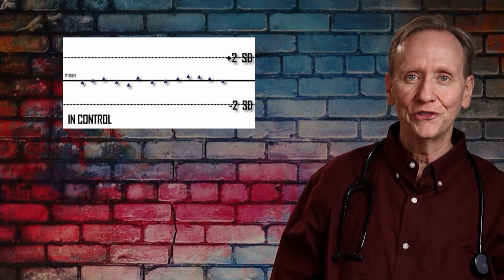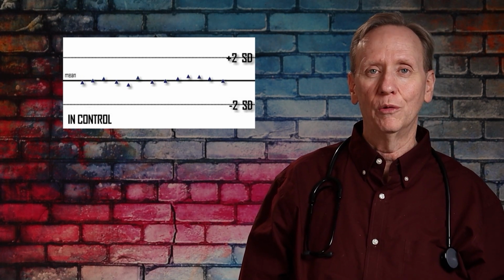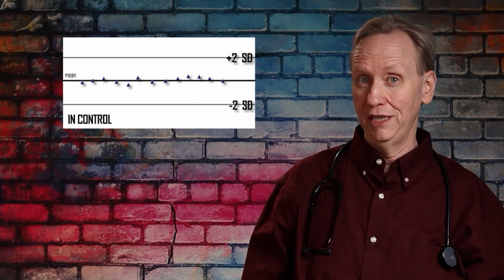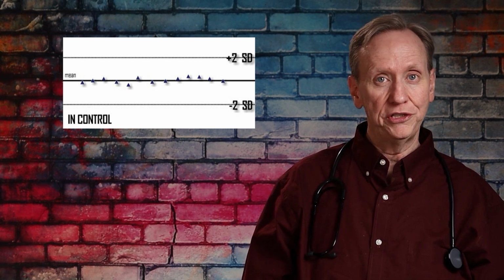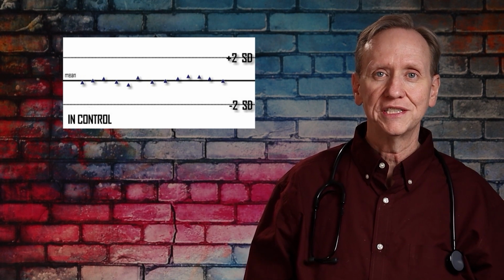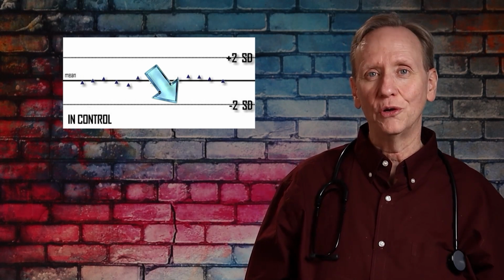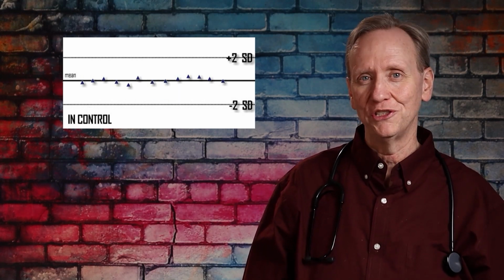If you look at this, you'll see that we have every shift a point shows up where we're analyzing. Now, I could put all kinds of labels on this graph. This might be for pH or CO2 or whatever. It doesn't really matter. What we're looking at is the points on the graph. What I do want to point at is some of the features on the graph. The first thing you'll notice is that as you look at the top part of the graph, it's got a top line and a lower line. This is called the upper and lower level control limits.